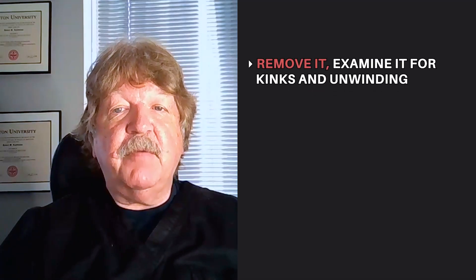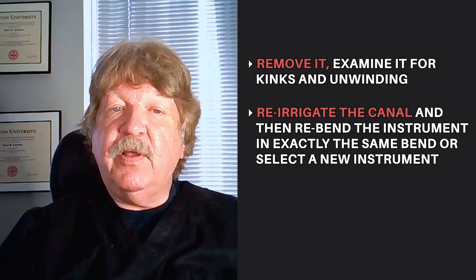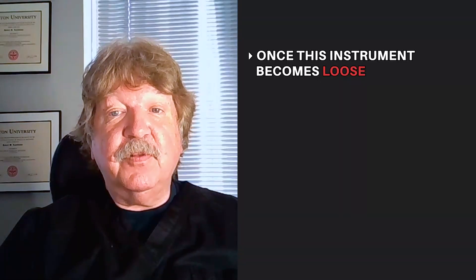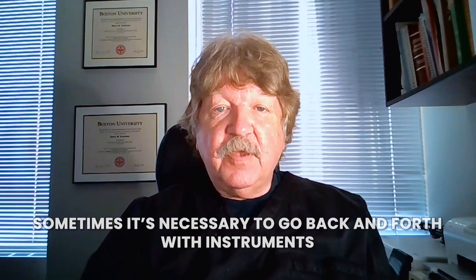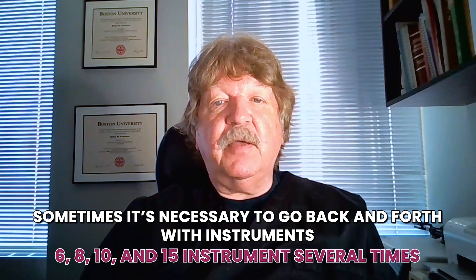Remove it, examine it for kinks and unwinding, re-irrigate the canal, and then re-bend the instrument in exactly the same bend, or select a new instrument, insert it at the same rotation angle with the same bend, and repeat the procedure. The amplitude of the instrument is very, very small. Once this instrument becomes loose, remove it, take a second larger instrument, bend it in exactly the same way, and return that instrument in exactly the same direction. Sometimes it's necessary to go back and forth with instruments such as the 6, 8, 10, and 15 several times. In some cases, I'll even go beyond the apex just slightly with very small sized files such as 6, 8, and 10s to check that I have reproducible patency.